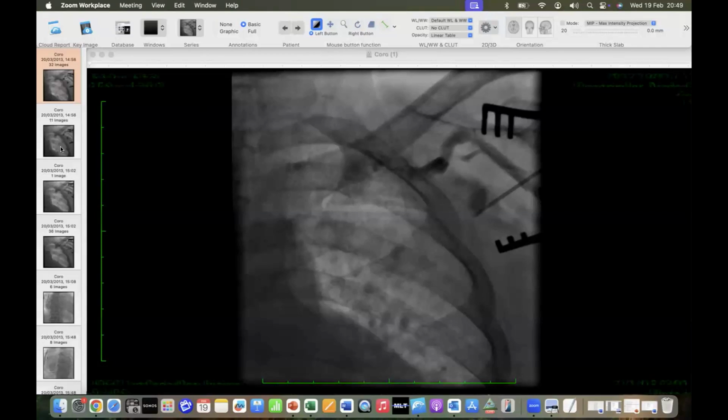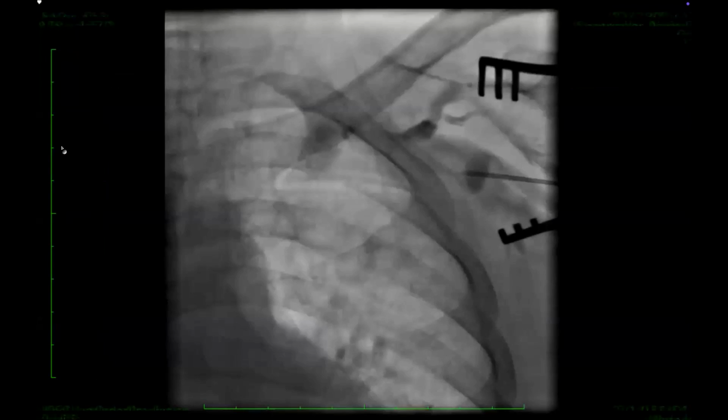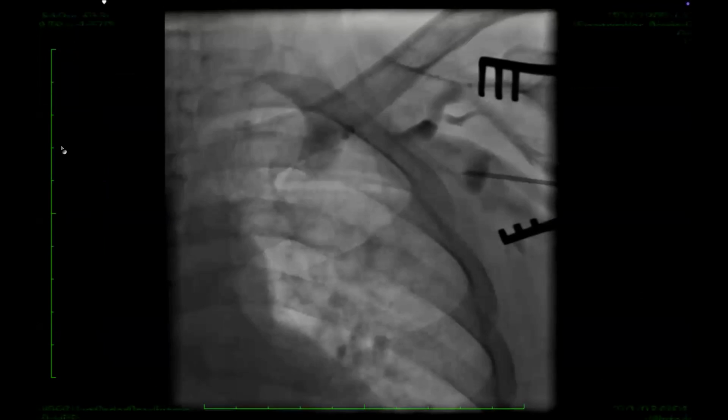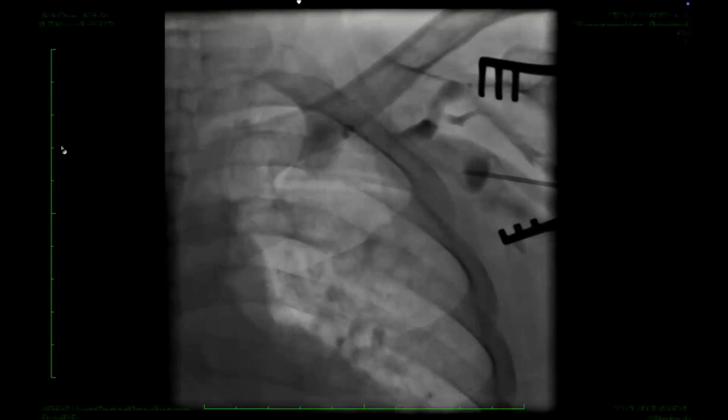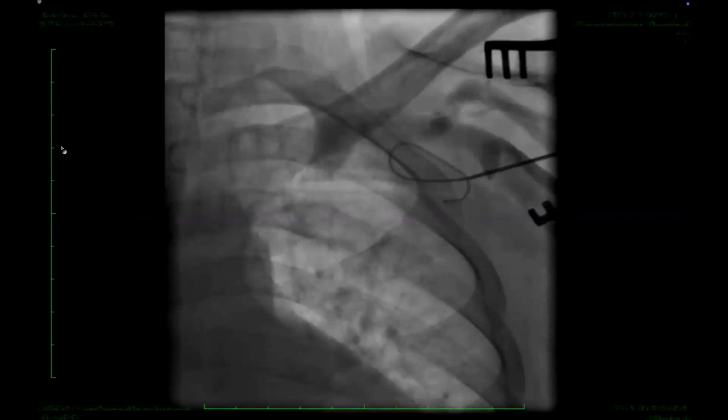Okay. So what I'm going to do is just walk through a little bit of what we've discussed. I think Dr. Hasham talked about getting venous access in a standard way, and we usually use a fluoroscopic approach if the patient's kidney function is satisfactory. We use a needle, and you can see that when we do the venogram, we can see contrast. Are you able to see the moving images now? Yeah. Excellent. So, let's see what this case showed.